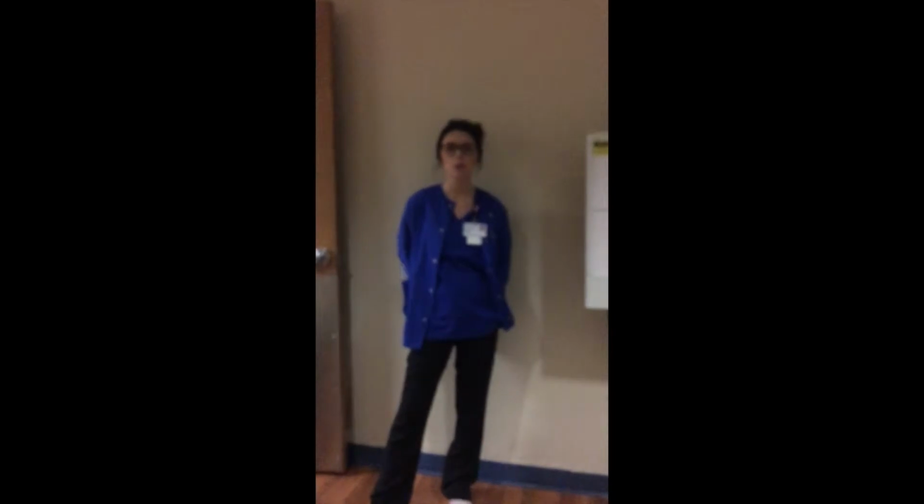My name is Shelby Hatcher, and my pathology is bone tumors. Normally, when diagnosing bone tumors, you would do a bone survey, which is imaging of multiple parts of the body. For the purpose of this video, I'm going to be doing an AP and lateral humerus due to the fact that the most common malignant bone tumors can be found in the upper arm.